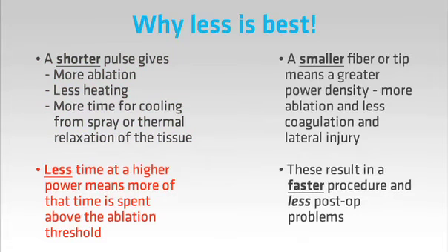Less procedure time. Using a higher power with pulsed modes means that we will be above the ablation threshold, so every pulse will cause cutting. We can do procedures quicker at higher powers. A smaller tip.